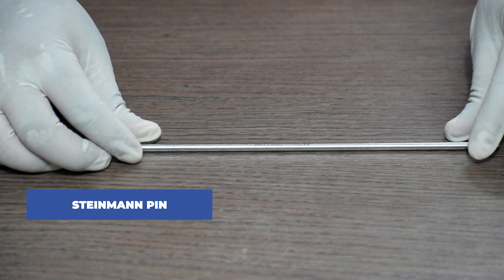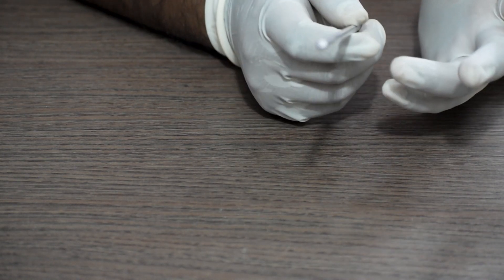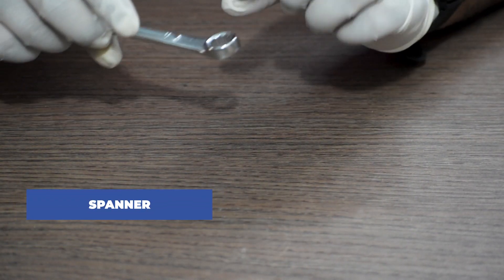Next we require a T-handle with chuck-end key. Next we require a size 11 spanner.